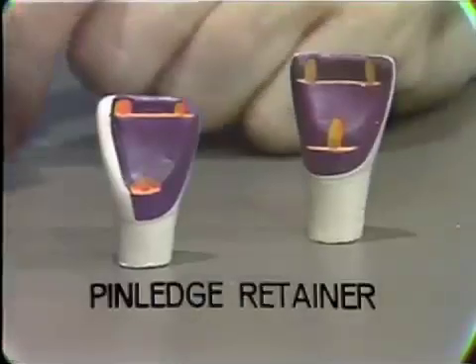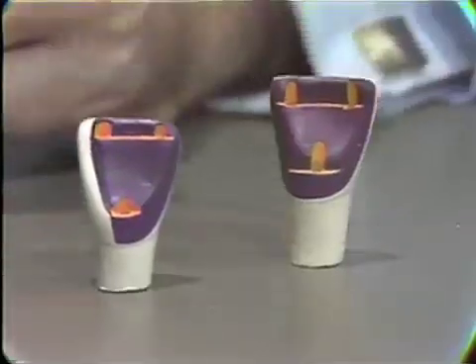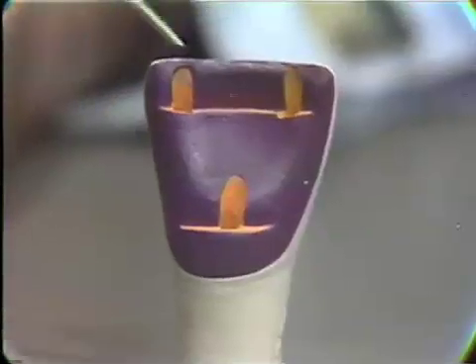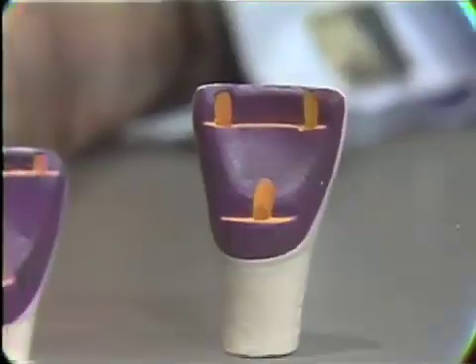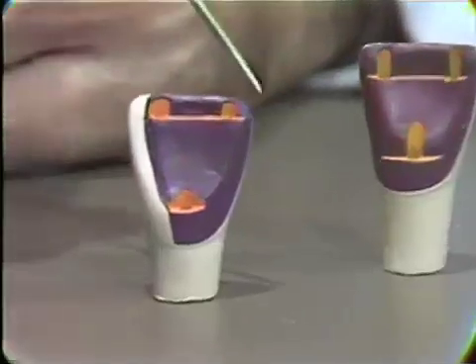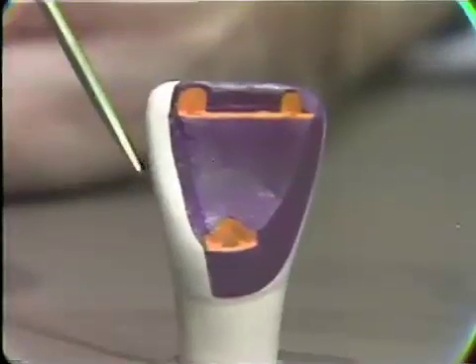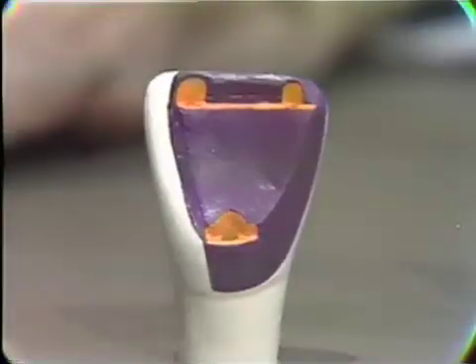On the one on the right-hand side of the screen, this one here is the so-called bilateral pin ledge, in which there is a slice on either side of the maxillary incisor, which this is, with 3 pins giving retention on the lingual surface. And over here on the left-hand side of the screen is the other variation of this, the unilateral pin ledge, in which only one side of the tooth is sliced. This has the advantage that it's not necessary to get involved in the contact situation on this side, and essentially the same amount of retention is gained by the 3 pins on the lingual surface here.